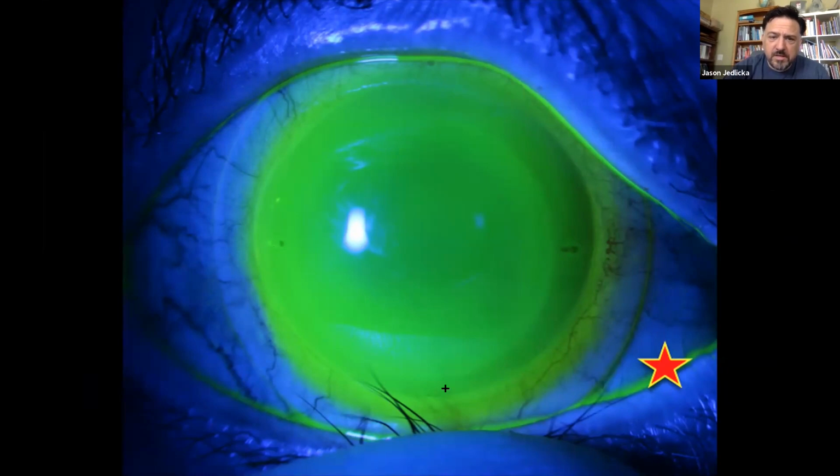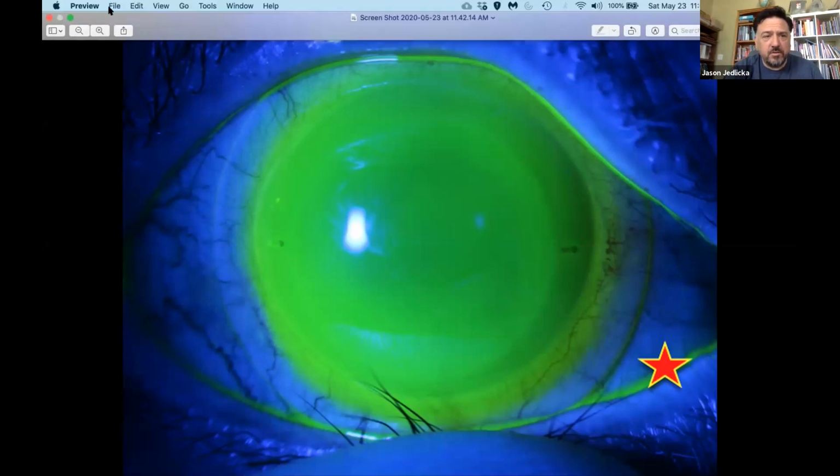And then again, that's because our corneas at the limbus, or if you don't want to be quite so nitpicky with this, you know, fraction of a millimeter difference in corneal diameter, just at a 12 or 13 millimeter chord across the entire eye, we're generally more elevated at 3 and 9, and we're generally more depressed or steep at 6 and 12. And so this is the fit it gives us in many cases. It gives us a situation where we have excessive clearance in the vertical meridian and less so in the horizontal.